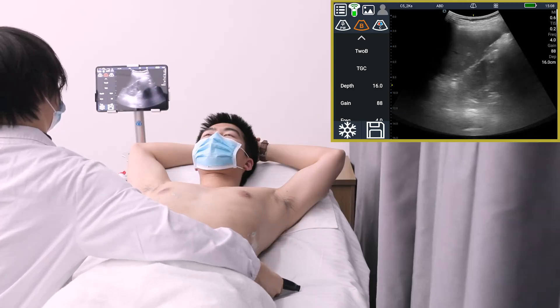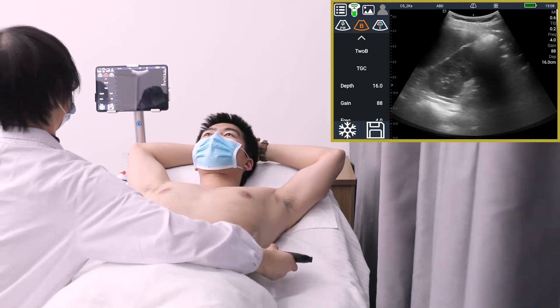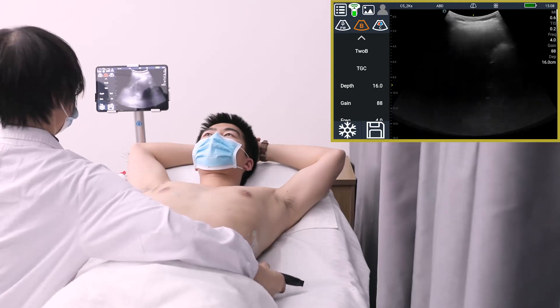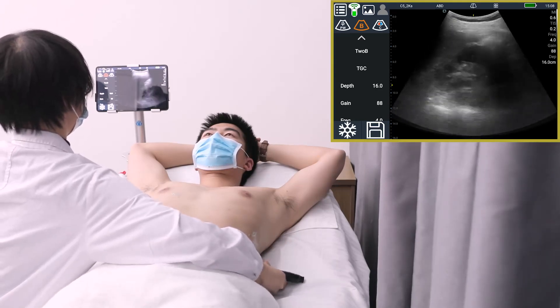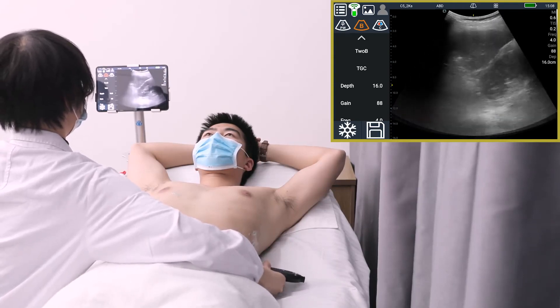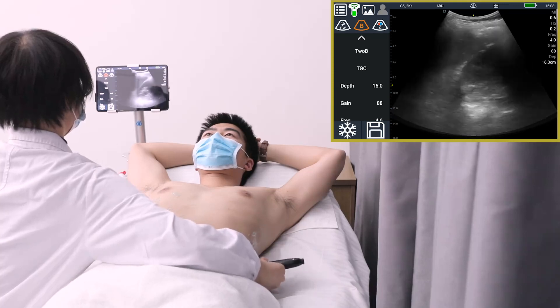Now let us look at the performance of the Yaoki Q7 wireless ultrasound scanner in an abdominal exam. We can see the spleen from this section — its shape, size, and swelling, whether the capsule is intact, and whether there is effusion in the space between the spleen and kidney.